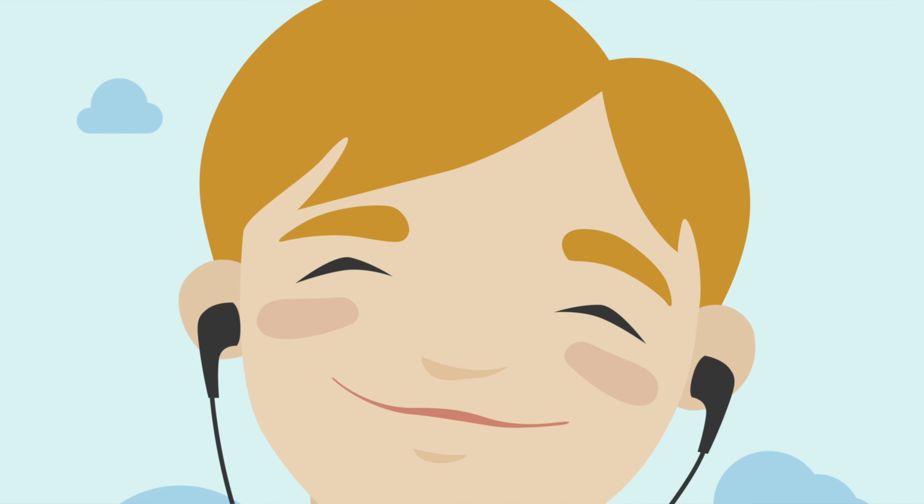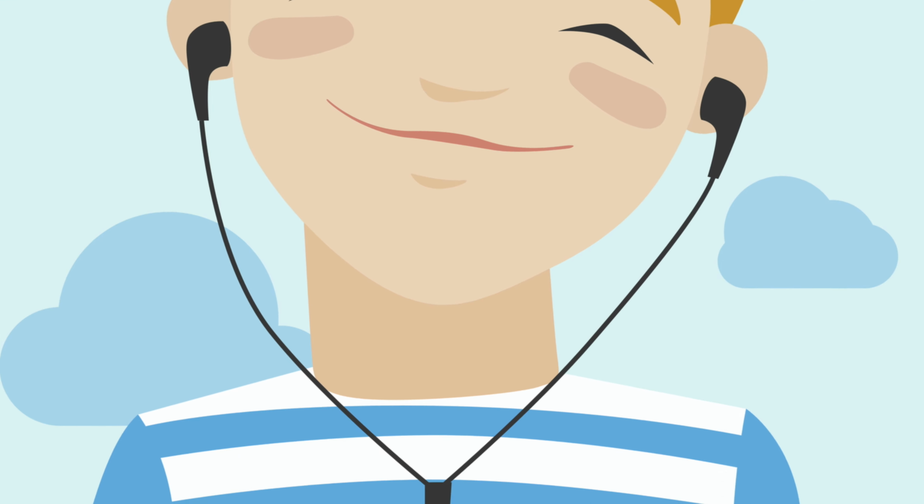But what about online learning? The sound quality provided by a computer or tablet does not provide the same quality of sound as a face-to-face interaction. Additionally, it's hard to monitor how loudly the teacher is speaking into the microphone at the distance learning site. Earphones are a possible solution to this difficult learning setup, but for students with hearing loss who already suffer with poor auditory input and processing, earphones are probably not enough. And earphones do not offer the hearing loss specific gain provided by hearing aids.